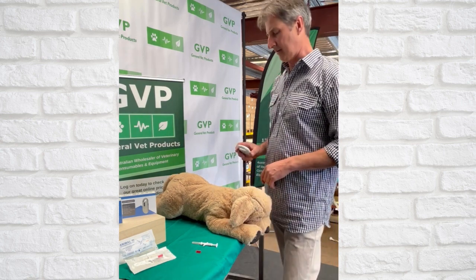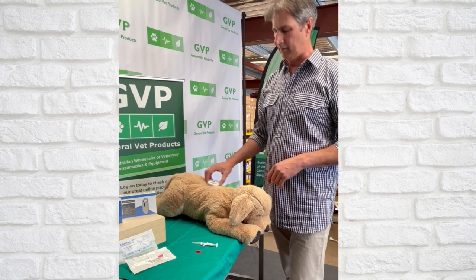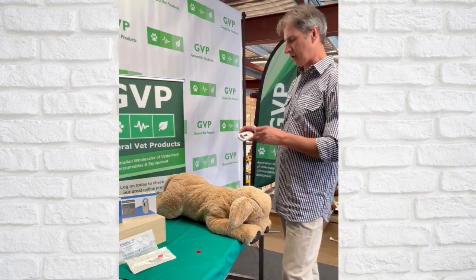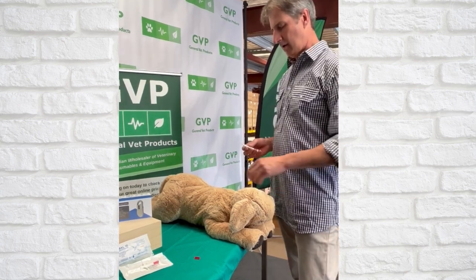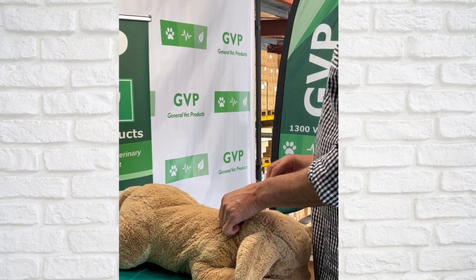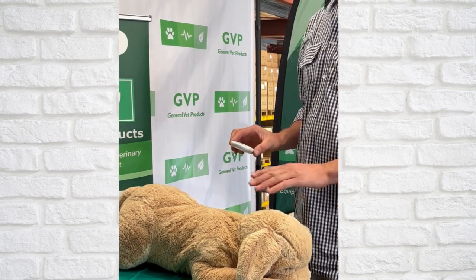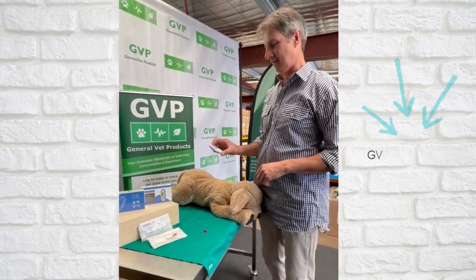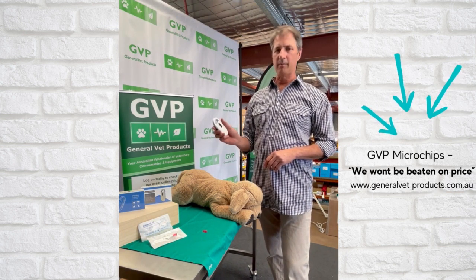Okay, let's go ahead and microchip Margarita. So obviously do your normal scanning first — nothing detected. There's a microchip number on the packaging so we've got six barcodes. Alright, very sharp needle, pinch the skin — Margarita is now microchipped.